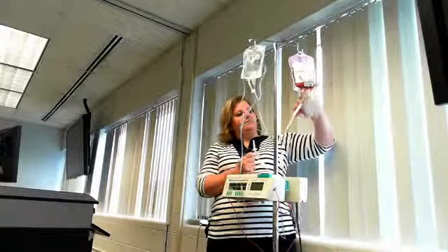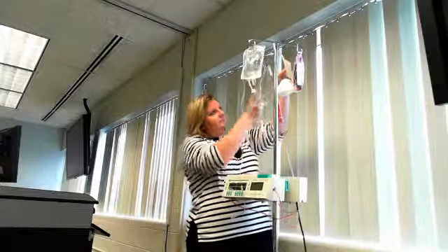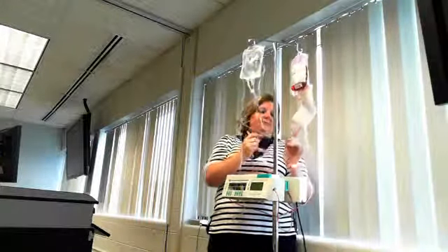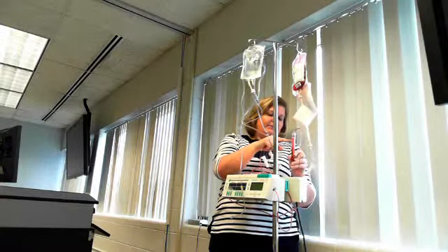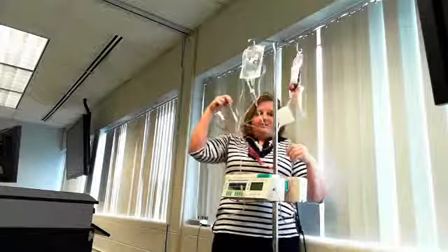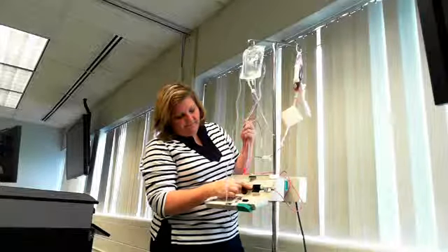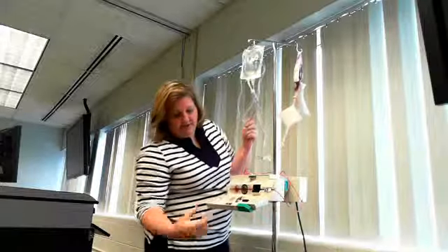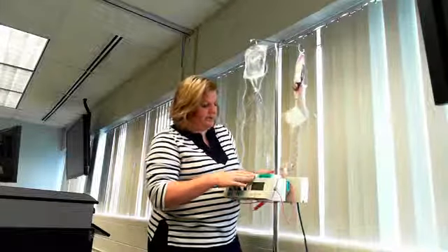Once the blood is spiked, the filter would need to be lifted while blood runs into it. Once blood has come all the way through and into the tubing, this part would have to be lifted and you would wait until blood is three-fourths of the way up before putting it back down. Then for the rest of the priming, you hold the drip chamber up just as you would when priming normal saline, getting it to the end of the tubing and inserting it into your pump.